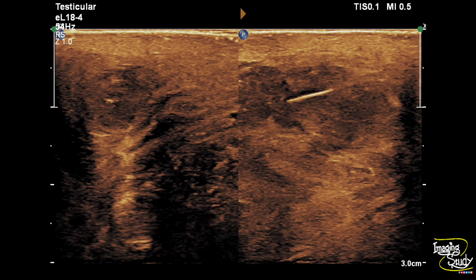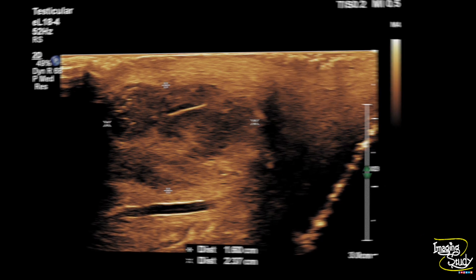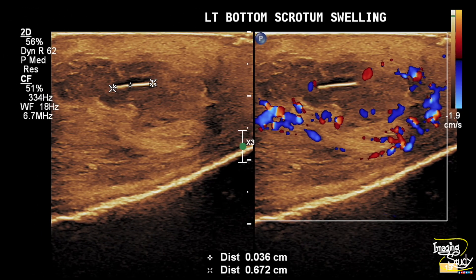Here's the picture — you can see this hyperechogenic linear structure with adjacent thin fluid collection and surrounding ill-defined zone of granuloma. Here's the measurement of the granuloma with the central echogenic foreign body. The structure is of around 6.5 mm length and 0.3 mm width. The surrounding vascularity is well seen here.